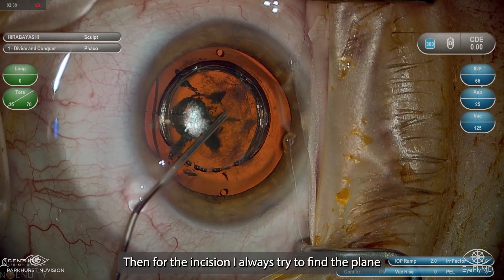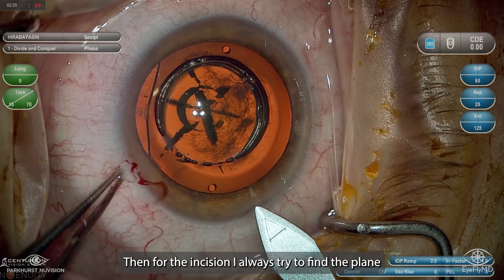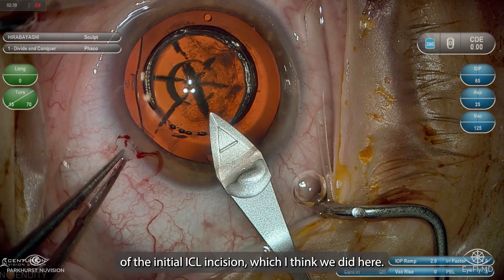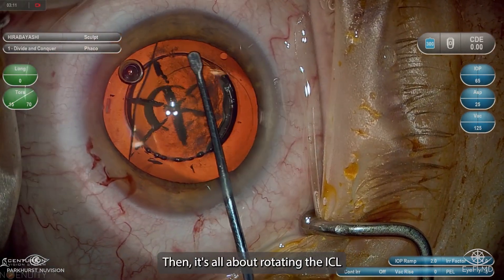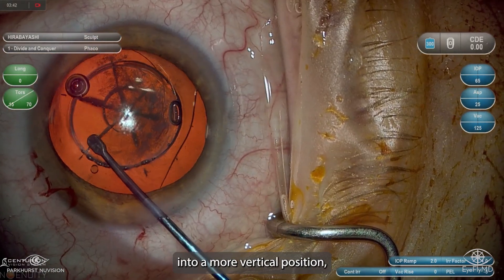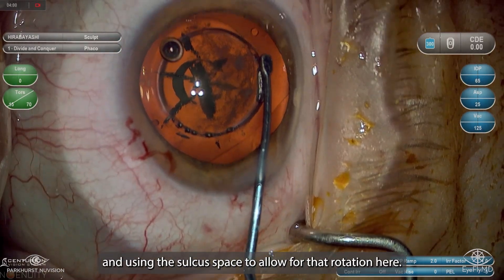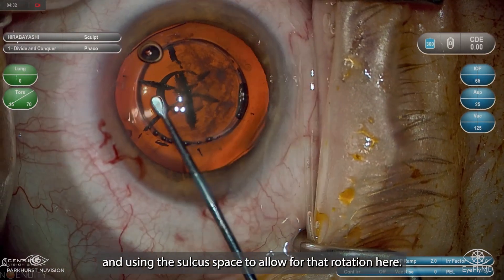And then for the incision, I always try to find the plane of the initial ICL incision, which I think we did here. Then it's all about rotating the ICL into a more vertical position, and this is just a matter of leverage and using the sulcus space to allow for that rotation.